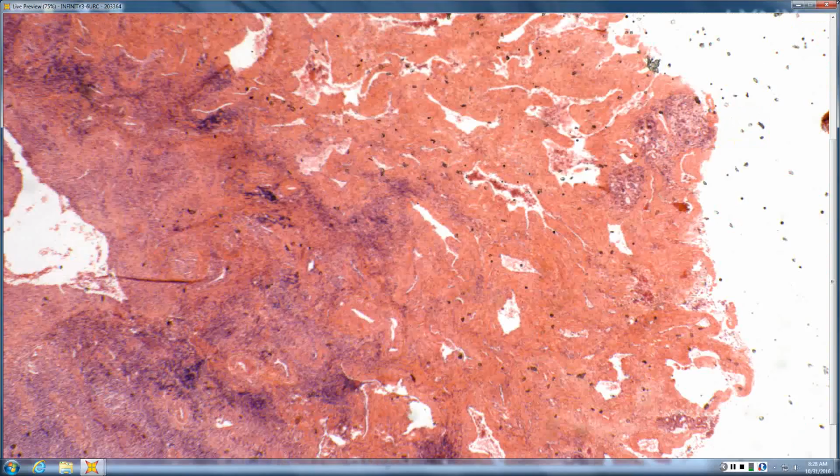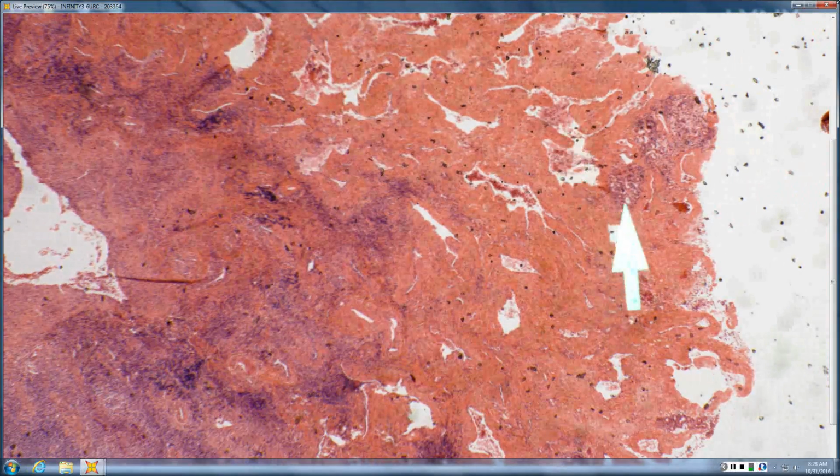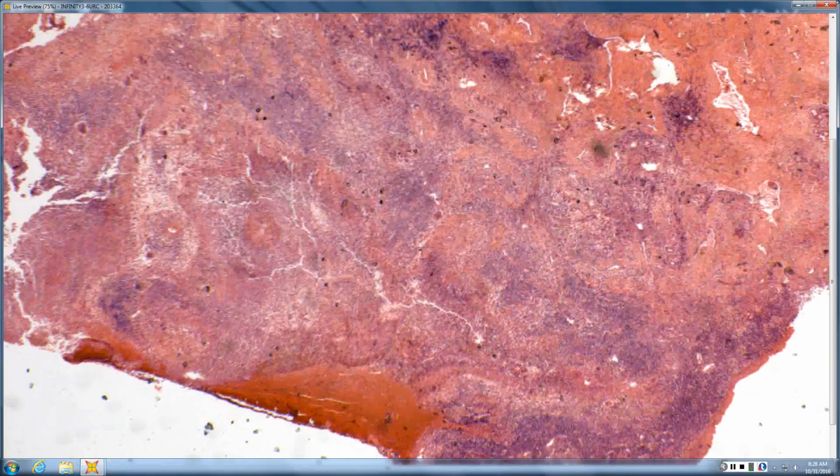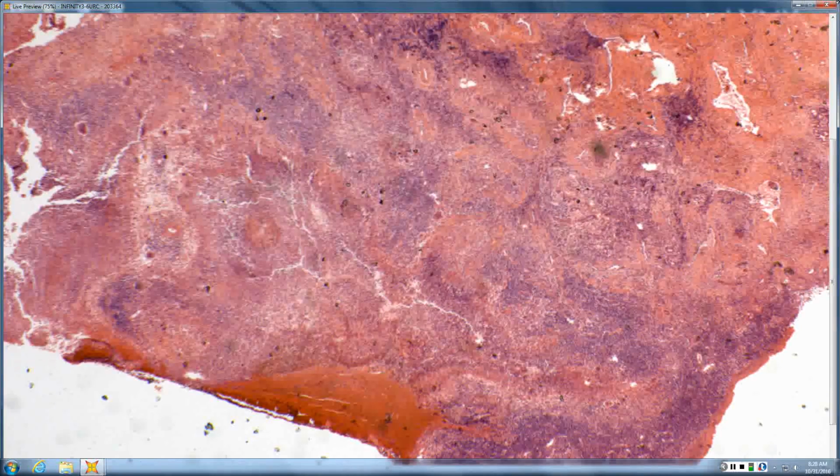That would never be genital erectile tissue because mucin glands there would just be gross. So this would be nasal mucosa, right? So erectile tissue with glands is nose, snotty nose, right? So GPA. Palisading granuloma with neutrophils in the center, schnoz.